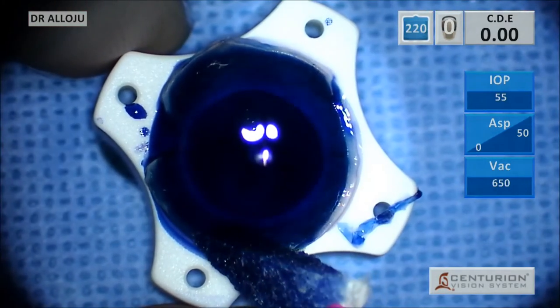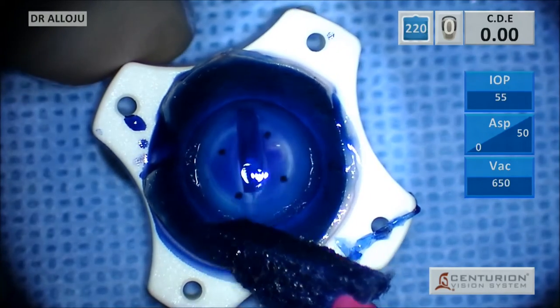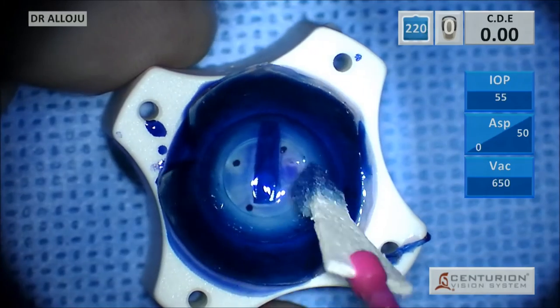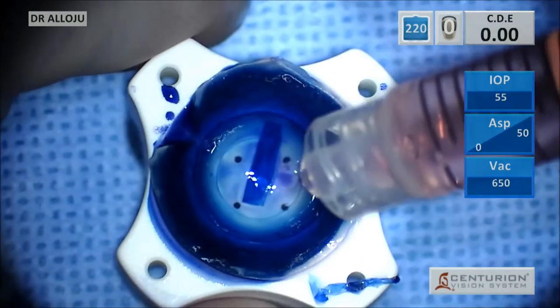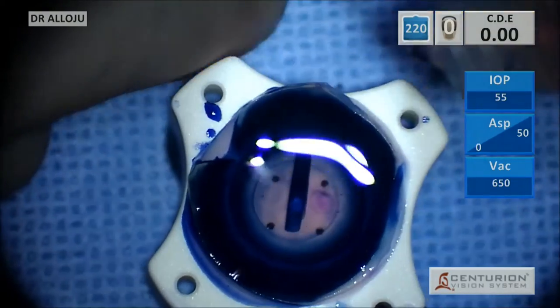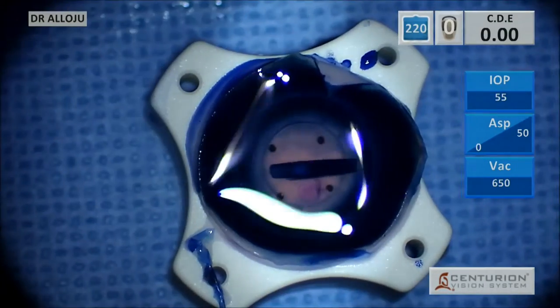Once that step's done, we're going to go back to our graft, basically draw up as much of the trypan blue as possible, put a little bit of Optisol in to kind of float our graft, and we have a nice tight scroll here.